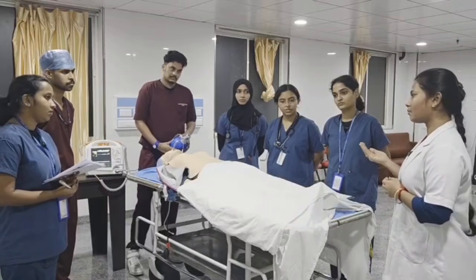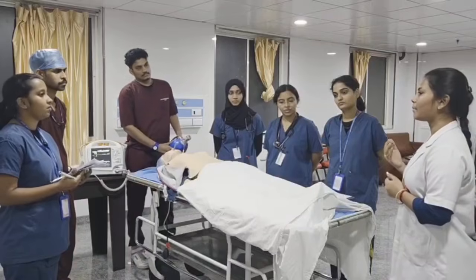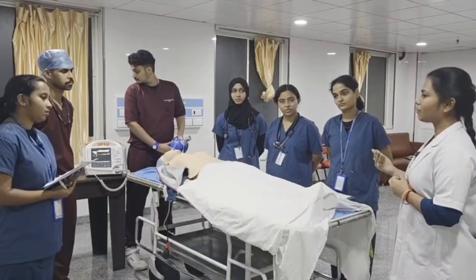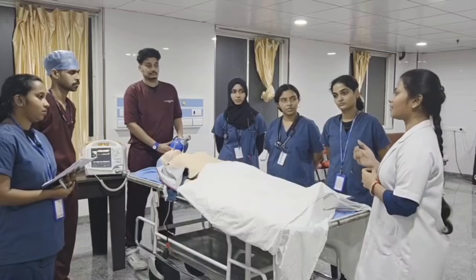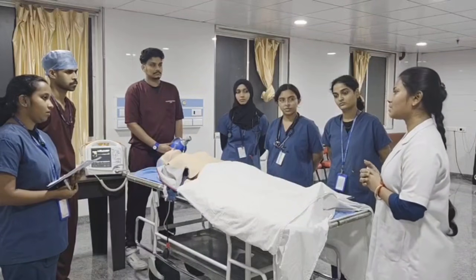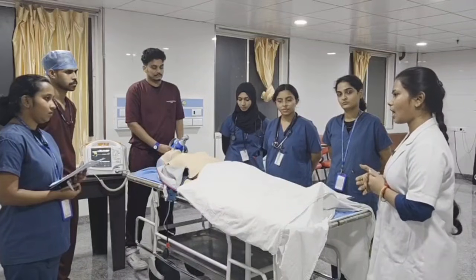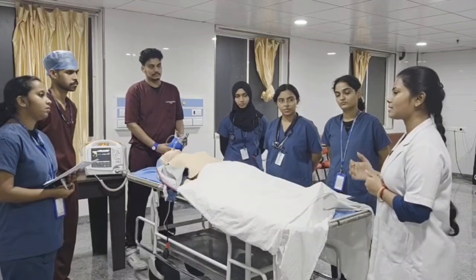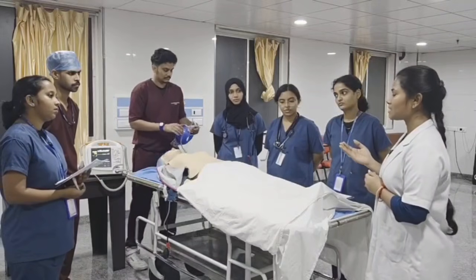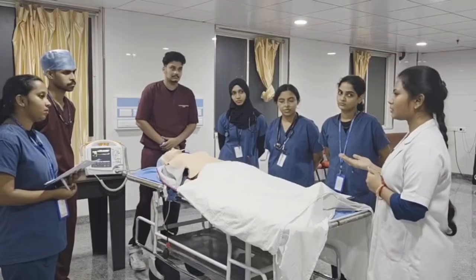And we proceeded with synchronized cardioversion. Before that, we prepared a consent, gave sedation and got the crash cart ready. Then after giving the first synchronized cardioversion, the patient is not responding and the rhythm is not showing any effectiveness. Then we proceeded with a second synchronized cardioversion, and after that we saw a rhythm change. The rhythm is showing ventricular fibrillation and we checked for the pulse. The pulse is not there.